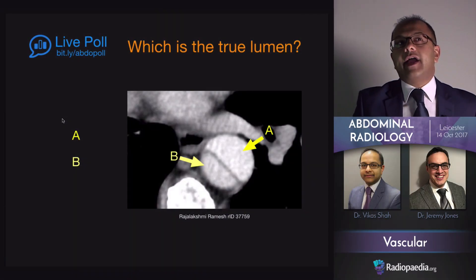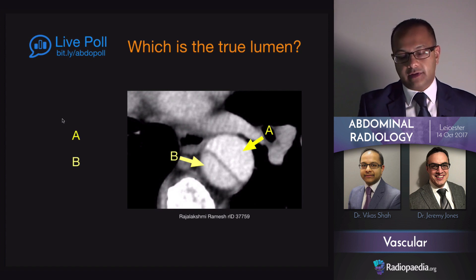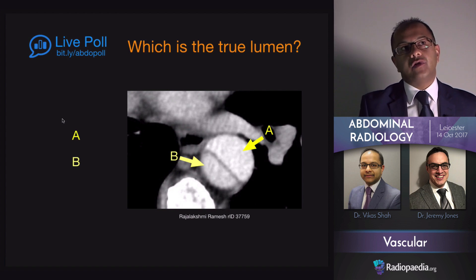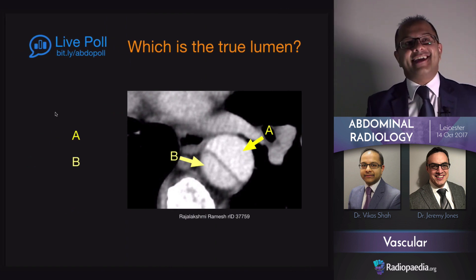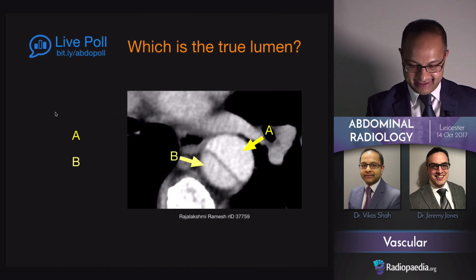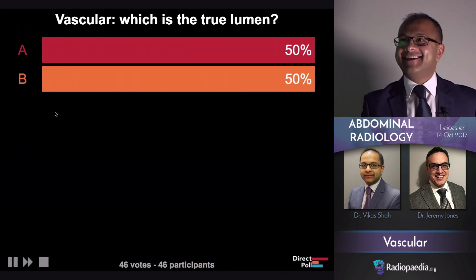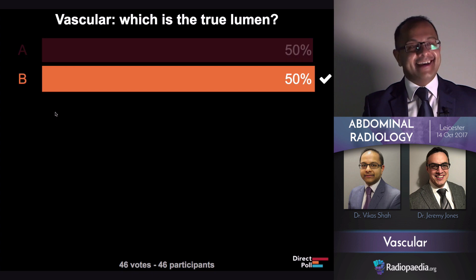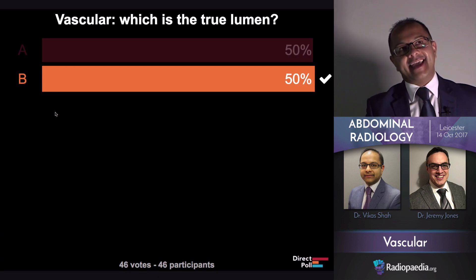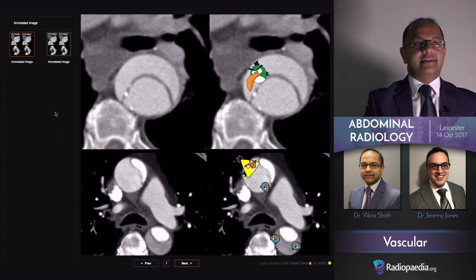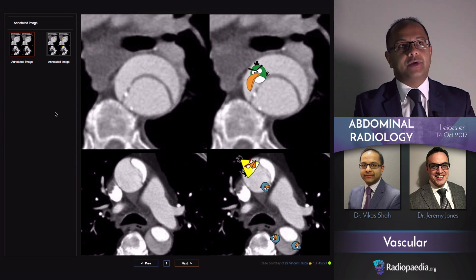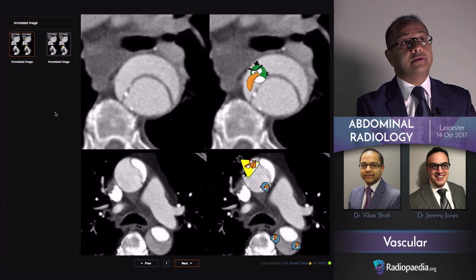It's important to try and identify which is the true and which is the false lumen. On this image, which one do you think is the true lumen of the aorta — is it A or B? It looks pretty even. In fact, B is the true lumen. There's something called the beak sign that can help you — the beak sign is a sign of the false lumen.